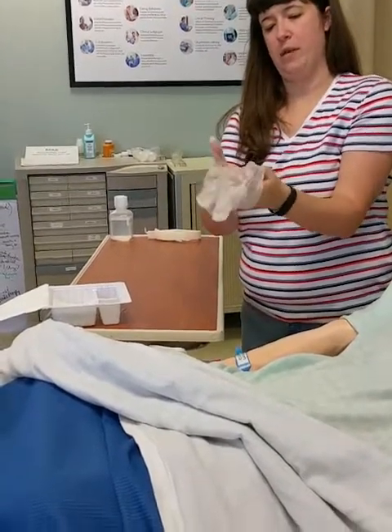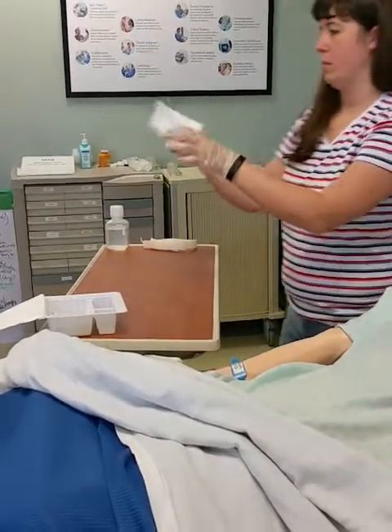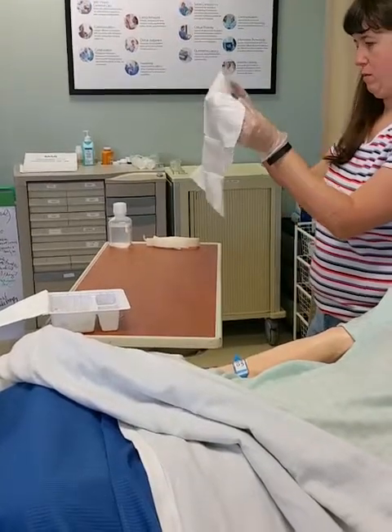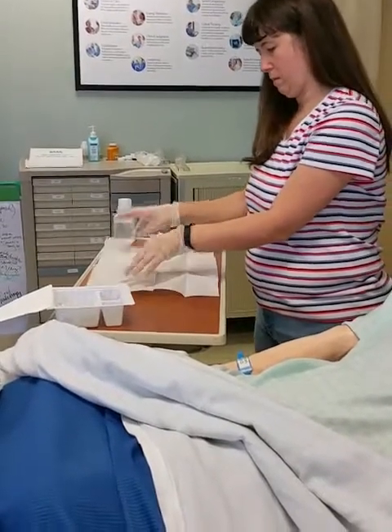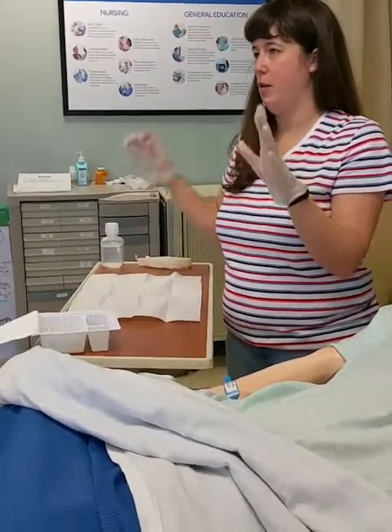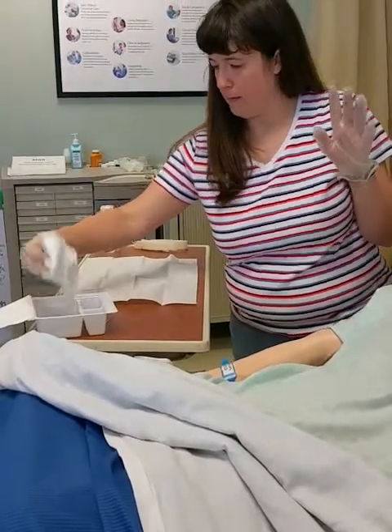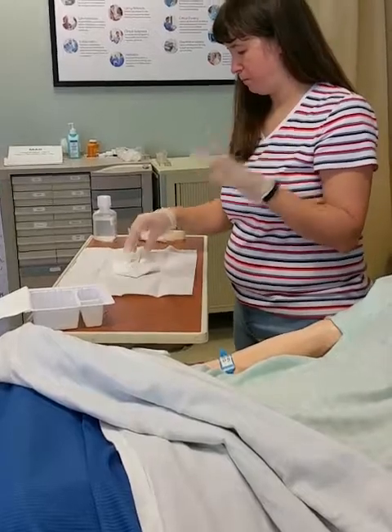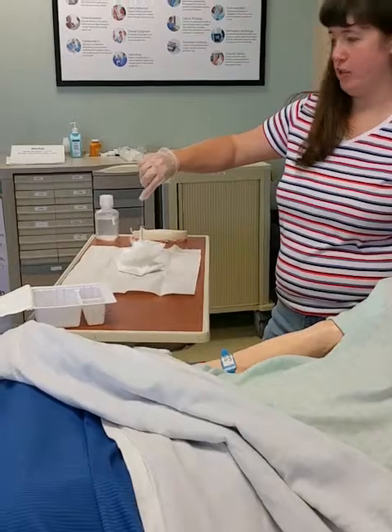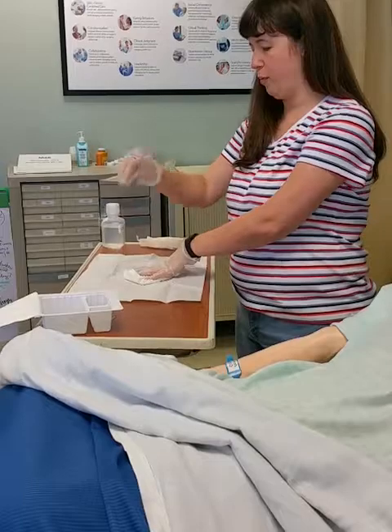Big trick is always where's the thumb. Okay. My sterile drape. Now, when you go to take the rest of the stuff out of the kit, reach in, grab all of it, and pull it out. And I'm going to show you why. Because this is what's going to happen. If you try and pull your stuff out of your sterile kit by pulling this, everything's going to flop and it's going to lose your sterile. So pull everything out.